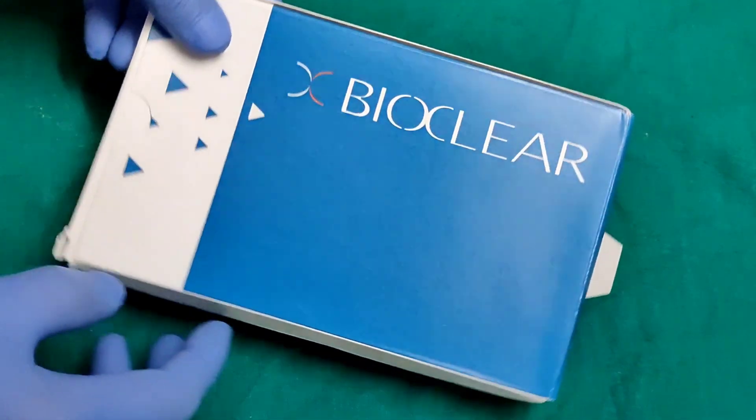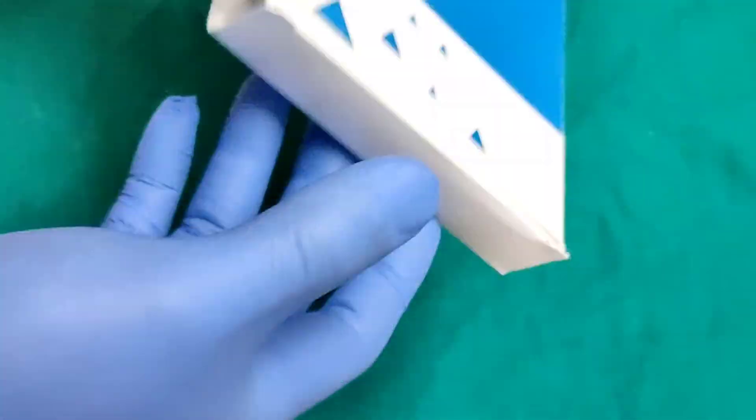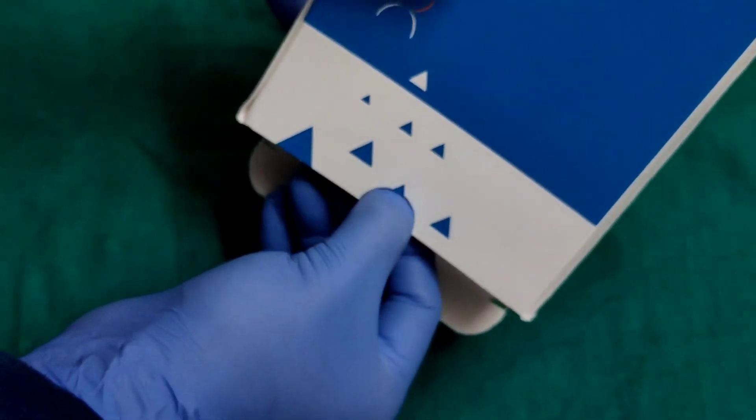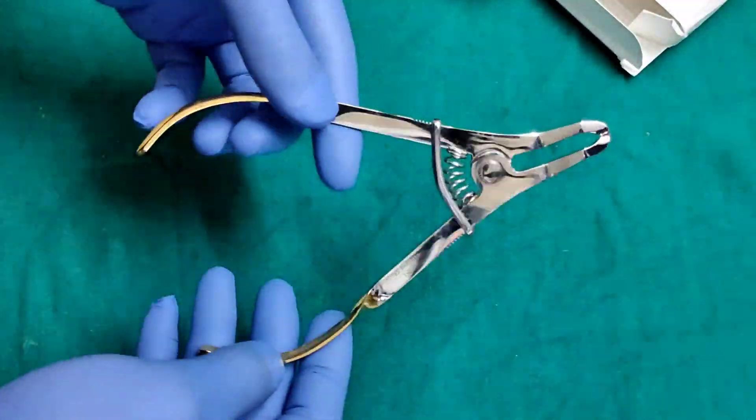BioClear's posterior matrix system also comes with the BioClear design forceps, which is used to hold and carry the twin ring to the site of cavity preparation.